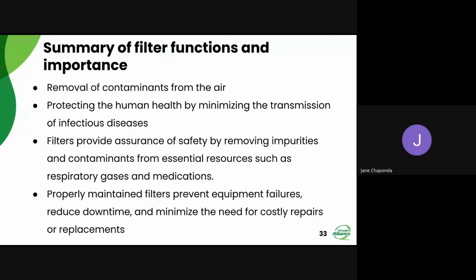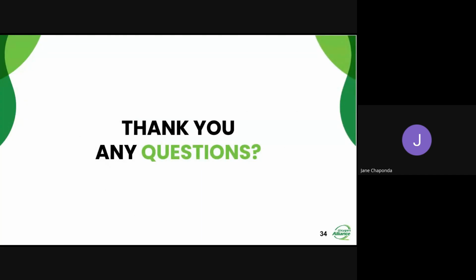All right, fine. So we should always dry our filters, the gross particle filters, that is the air intake filter, in a shady area and not under the sun. This is because this filter is made with a material that easily disintegrates when it is being dried under the sunlight. So we should always make sure that we dry this filter in a shady place. Thank you.